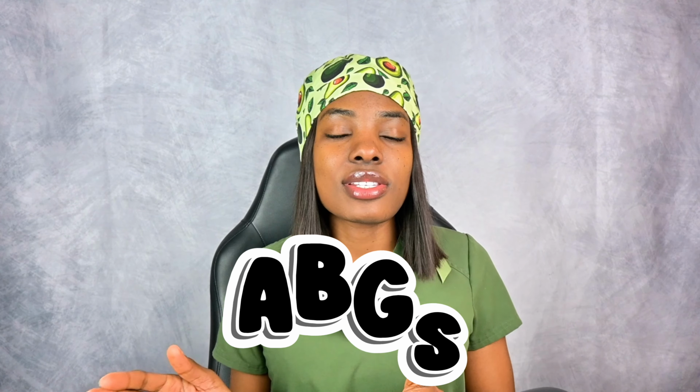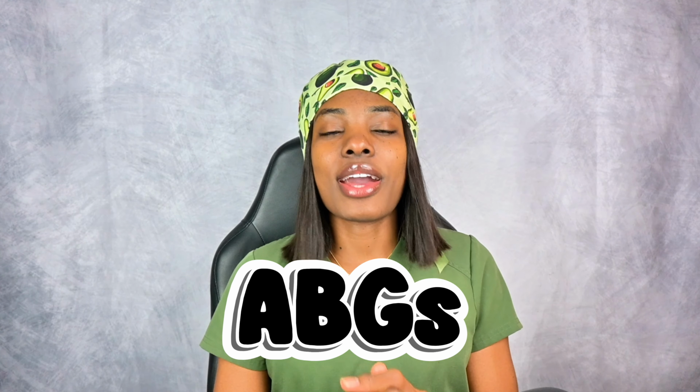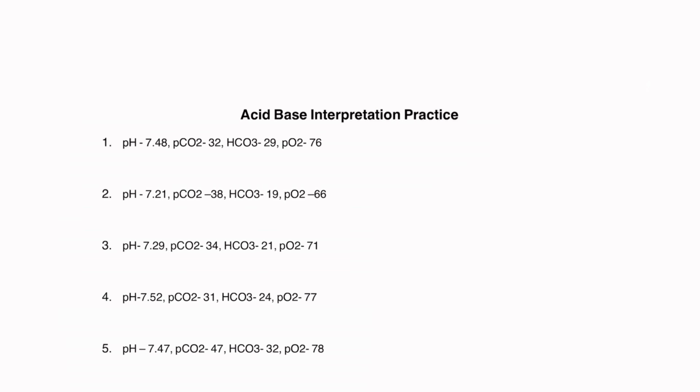On today's video, we're going to be talking about ABGs. I love calculating arterial blood gases, ABGs for short, and I use the Tic Tac Toe method. I find this the easiest, the simplest. I feel like you can never go wrong with this method, so come along as I show you how I do it. As we all know, we have our pH, the PCO2, the HCO3, and the PO2.